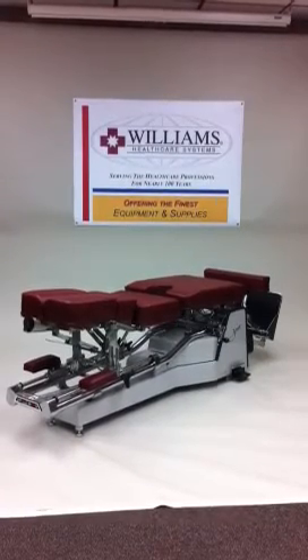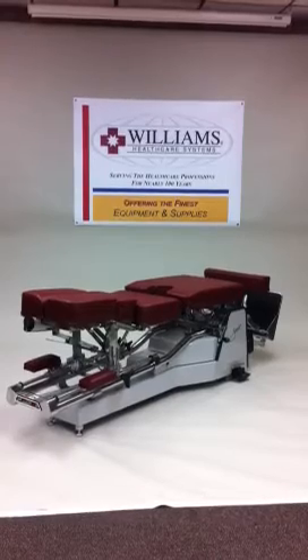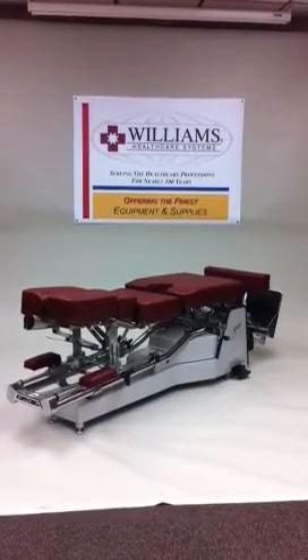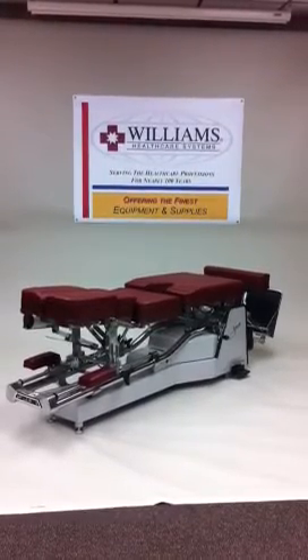Starting at the front, the traditional comfort of our face cushion tilts up and down and adjusts for width. It includes face paper toweling and dispenser. The soft hinge dorsal cushion provides for patient comfort.